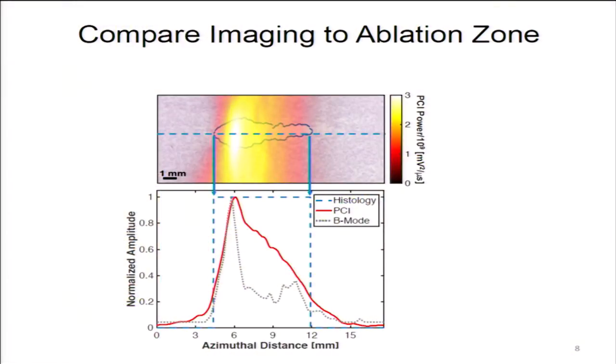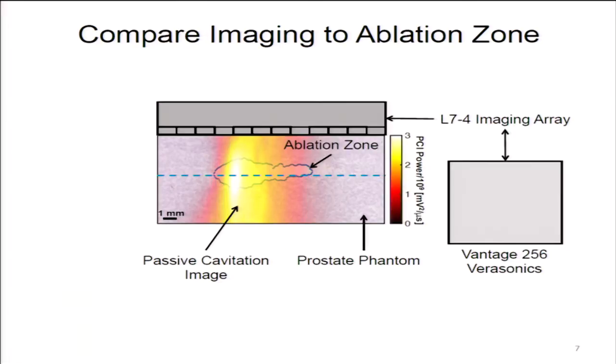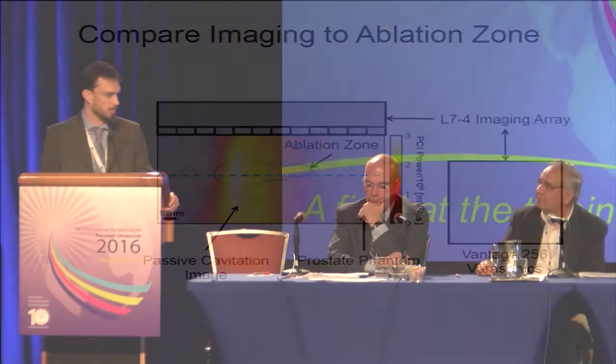Yes. Okay, yeah, that has to do with a limitation of passive cavitation imaging. This is our imaging array, and there's an elongation of the point spread function for that beamforming algorithm, so it smears the cavitation perpendicular to the axis of the imaging array. This is something that is currently a source of pain and confusion, but we're working on some newer imaging algorithms. At the University of Oxford, they are implementing what's called the robust Capon beamformer that tends to reduce that artifact. We're also working on some of our own approaches.